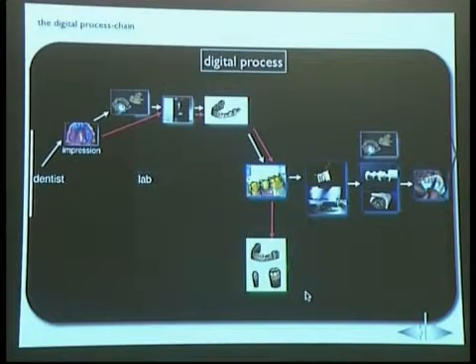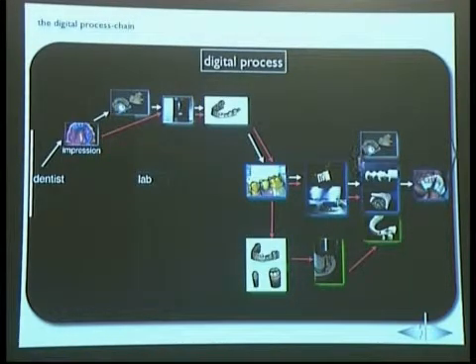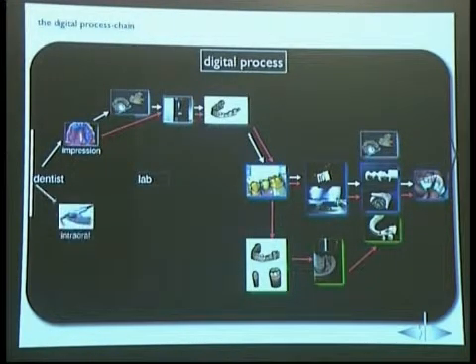And then, from the model part, we have to manufacture the models. Next step, not a process we have known for 20 years. It's a new process, manufacturing models. And then going also into the production line, put the models together to the work, and the next step, again, going to make the hand job.